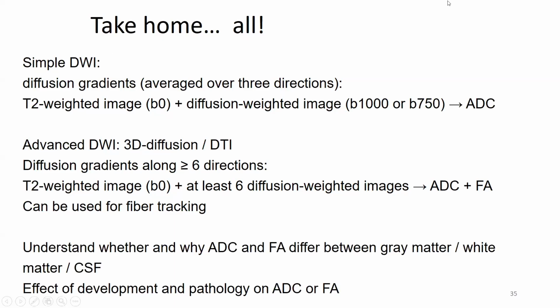And it's nice if you understand whether and why the ADC or the FA differ between white matter, gray matter, and CSF. That's always good to know. And also know a little bit about the effect of development, but also what a few different pathologies have on ADC and probably on the FA.